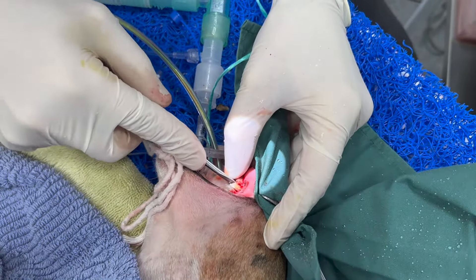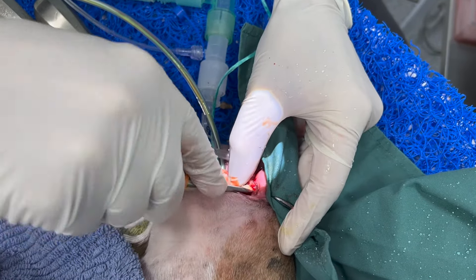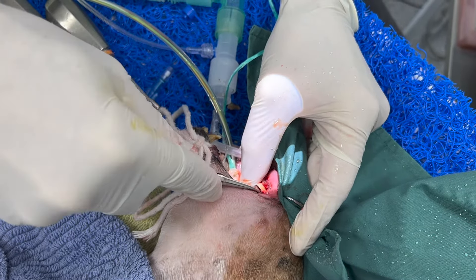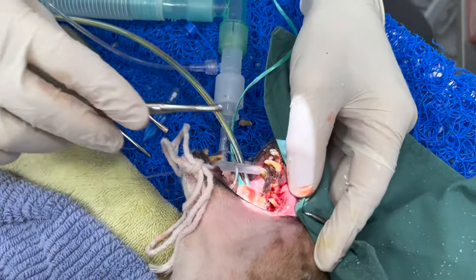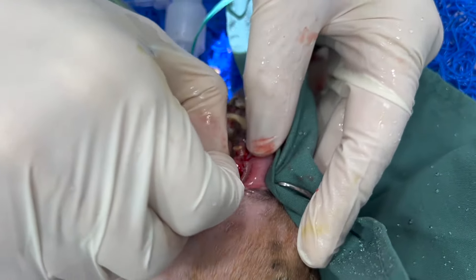I'll use different size elevators. By singing 'Happy Birthday' you can actually apply gradual pressure onto a root. You can see that's putting pressure on the root — not on the nurse's ears.